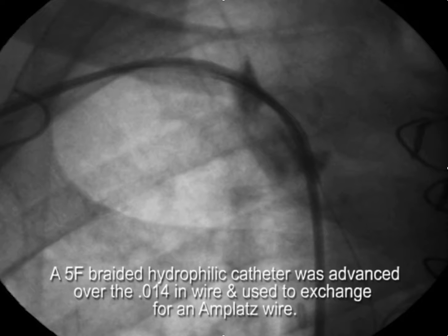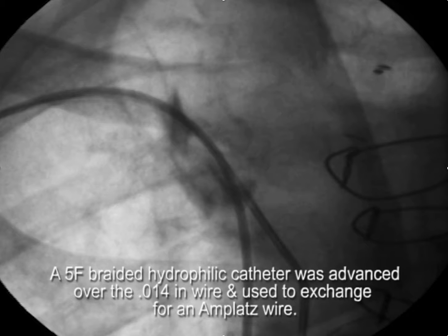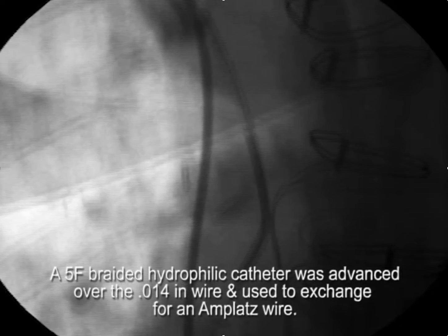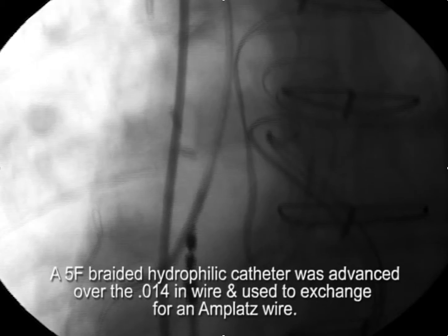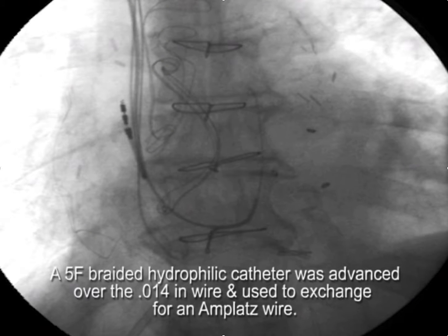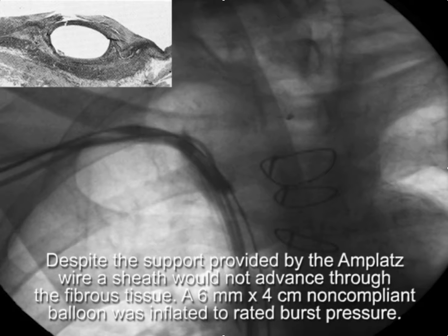To get better support, we want to upsize the angioplasty wire, so we're going to use a braided hydrophilic catheter to exchange the 0.014 wire for an AMPLATZ extra support wire. Once we have the braided catheter in place — you can see that here — we take out the angioplasty wire and put in the AMPLATZ wire.